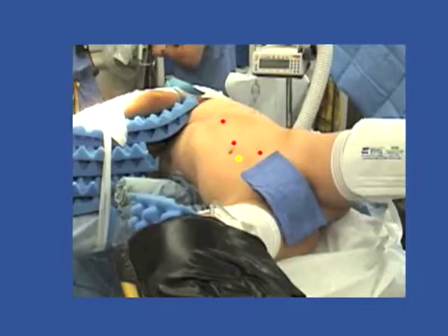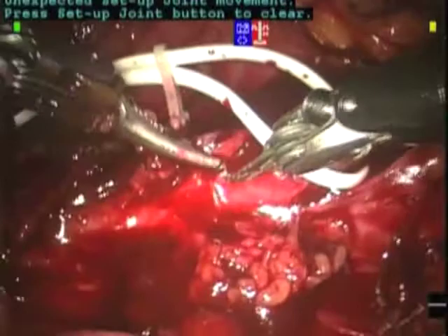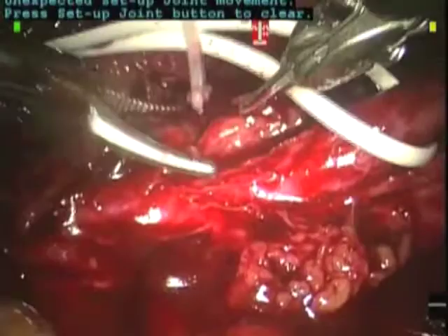Here we pick up the video where the colon has already been reflected medially. You can see the normal proximal ureter isolated with a vessel loop as it enters the fibrotic mass. The steps to releasing the ureter from this fibrotic mass are as follows: first, anteriorly incise the mass over the ureter.